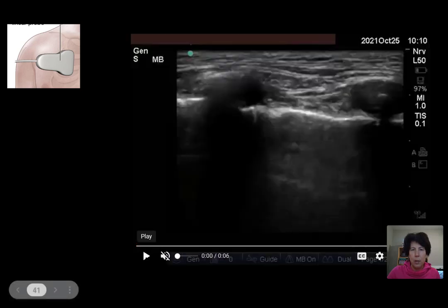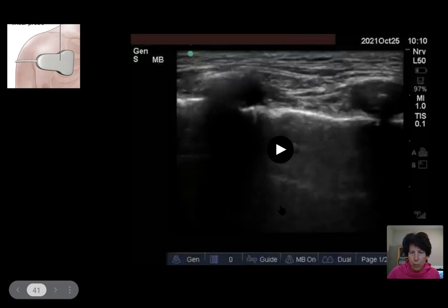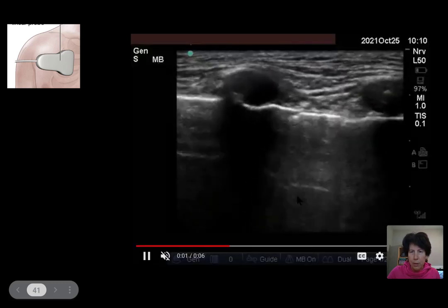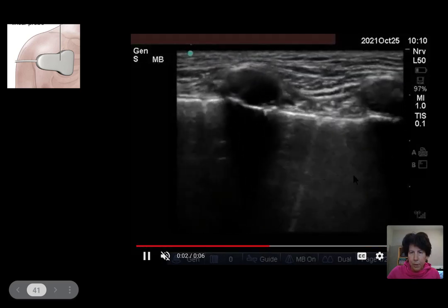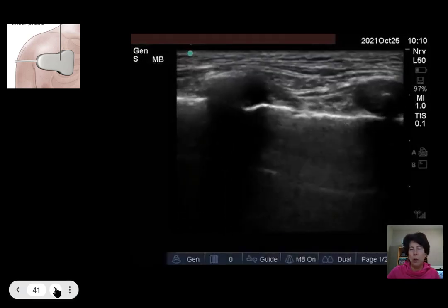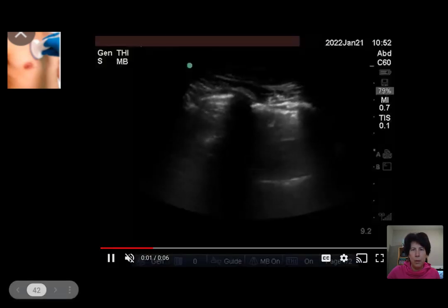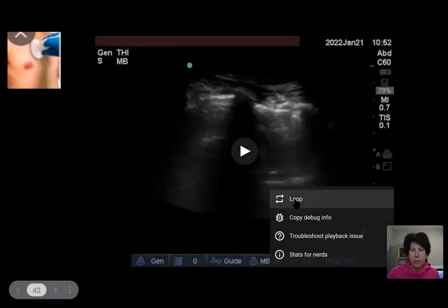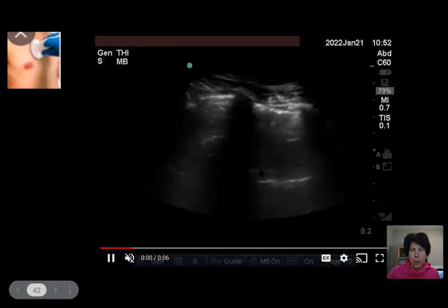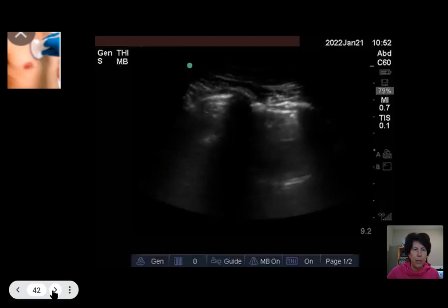This is another lung slide, a normal lung, just to get a little bit of experience looking at that. You can see the slide more. There are some B-lines here. You can see those little strobes to the end of the field. Those are B-lines. This is coming up to more than 3 in a field, but still probably normal. So these are all what normal lung would look like. And this is lung pulse. So keep an eye on it. Pulse. Okay, that's what lung pulse looks like.